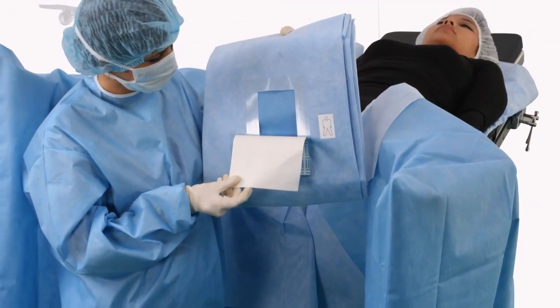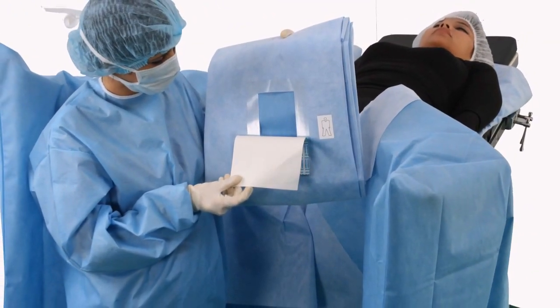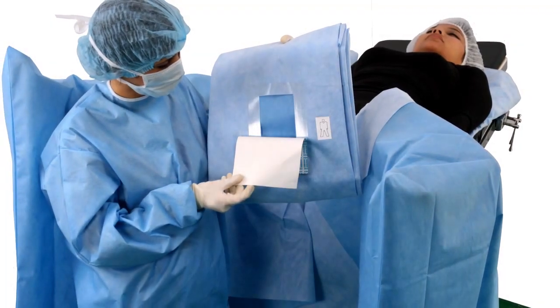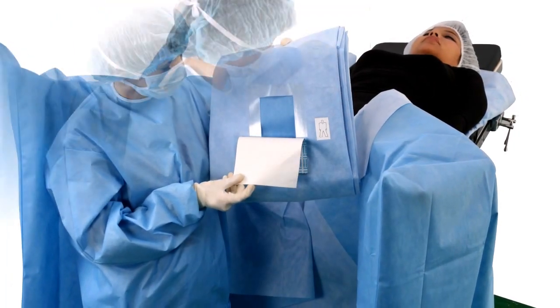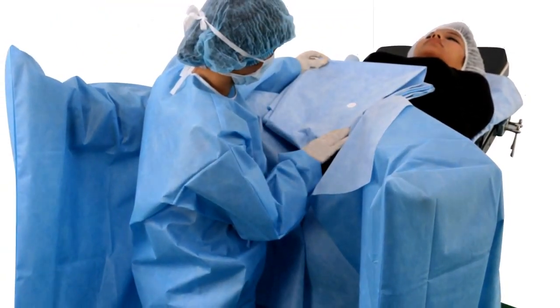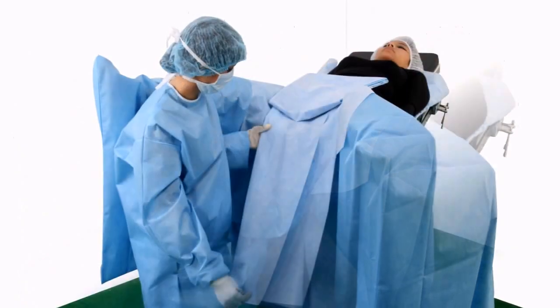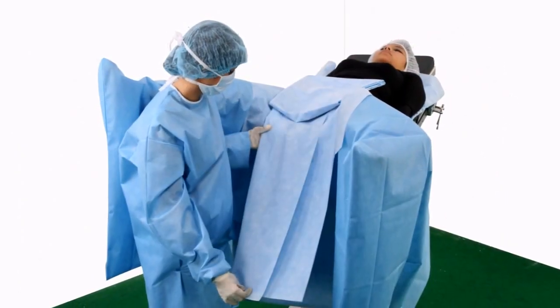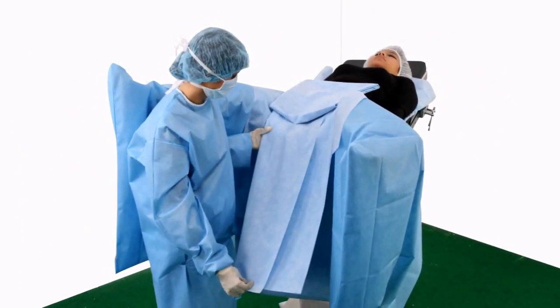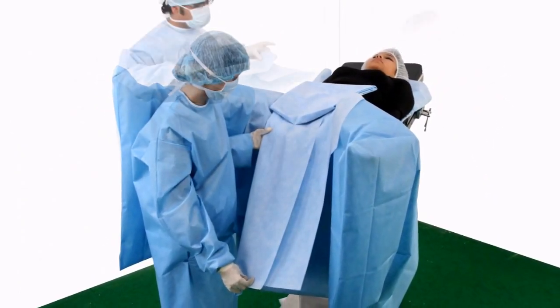Turn drape over and remove fenestration release paper. Position drape over perineal area. Unfold drape down toward floor.